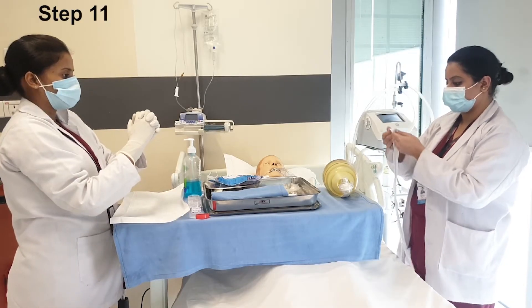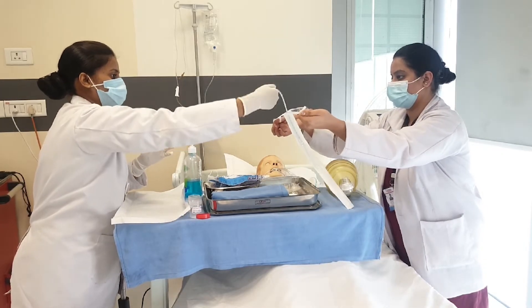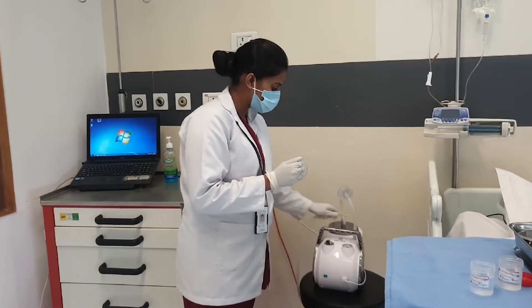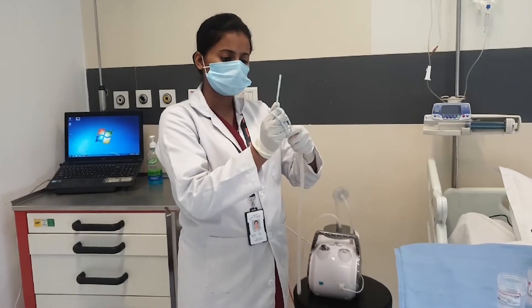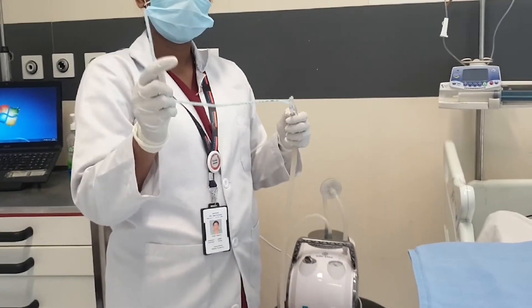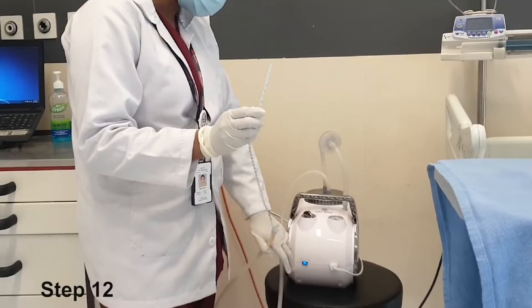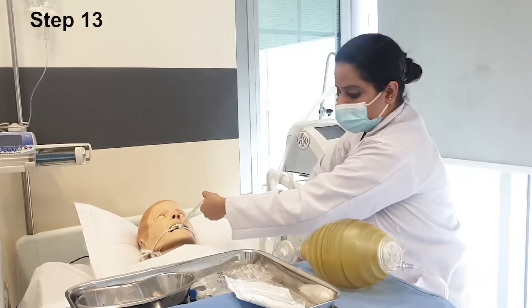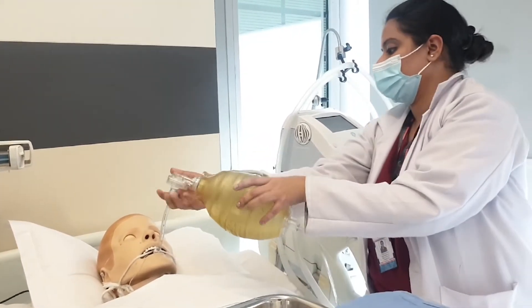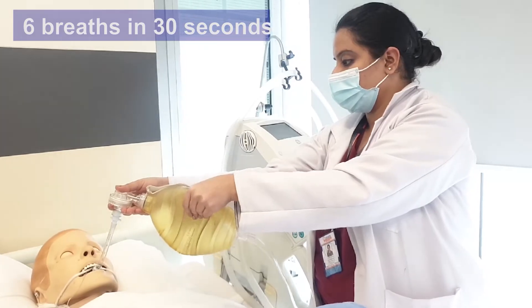The assistant will provide the suction catheter in a sterile manner, and the assigned nurse will hold the suction catheter with the dominant hand. The assigned nurse will attach the suction catheter to the tubing with the non-dominant hand. The assigned nurse will set the suction pressure. The assistant will disconnect the patient from the ventilator and give pre-oxygenation through the ambu bag — that is 6 breaths in 5 cycles, which is 30 seconds.